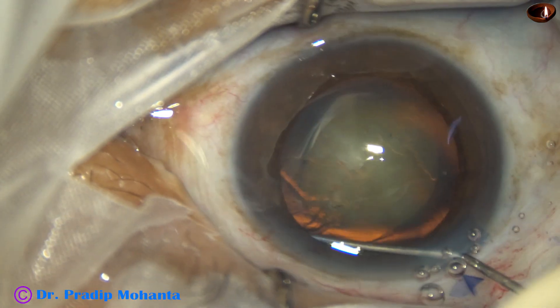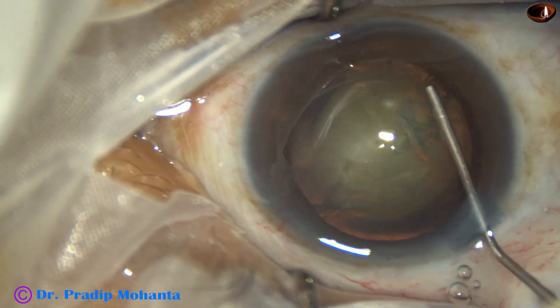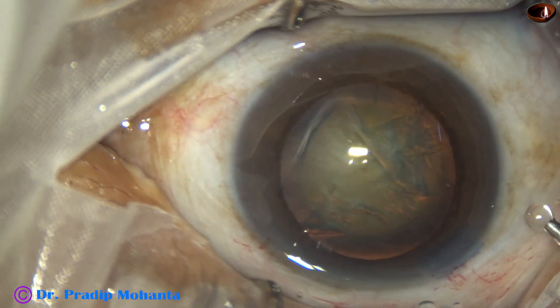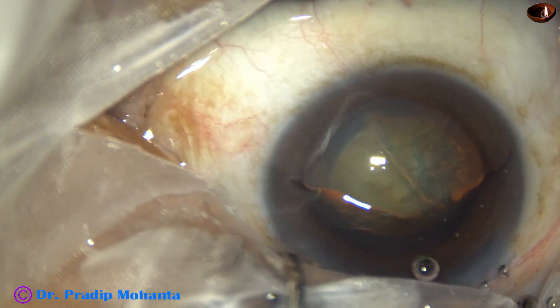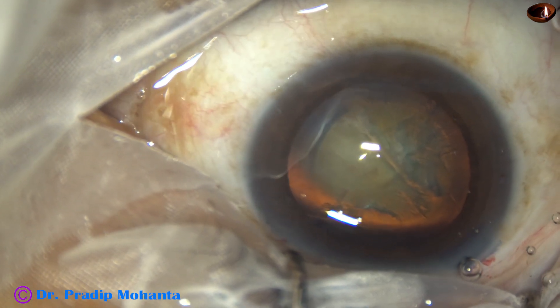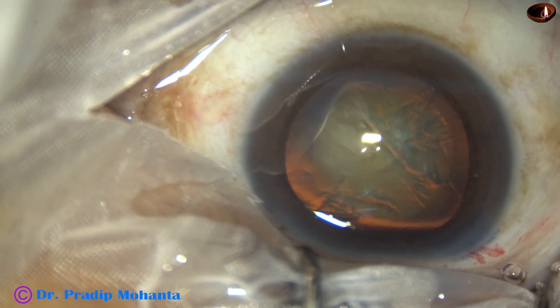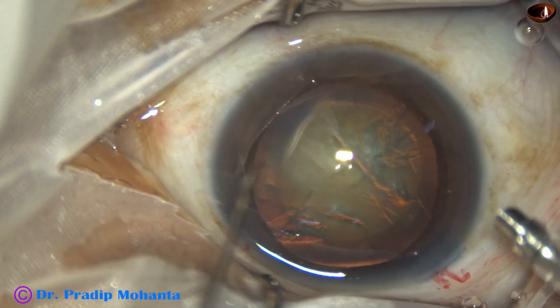Hydrodissection is done with a 27-gauge cannula and BSS. The anterior chamber is again filled up with viscoelastic — 2% HPMC. In this surgery, my aim is to show the pit and chop technique: make a pit just in front of the main incision, go to the floor of the pit, go into the substance in front, go for a distance, and then chop.